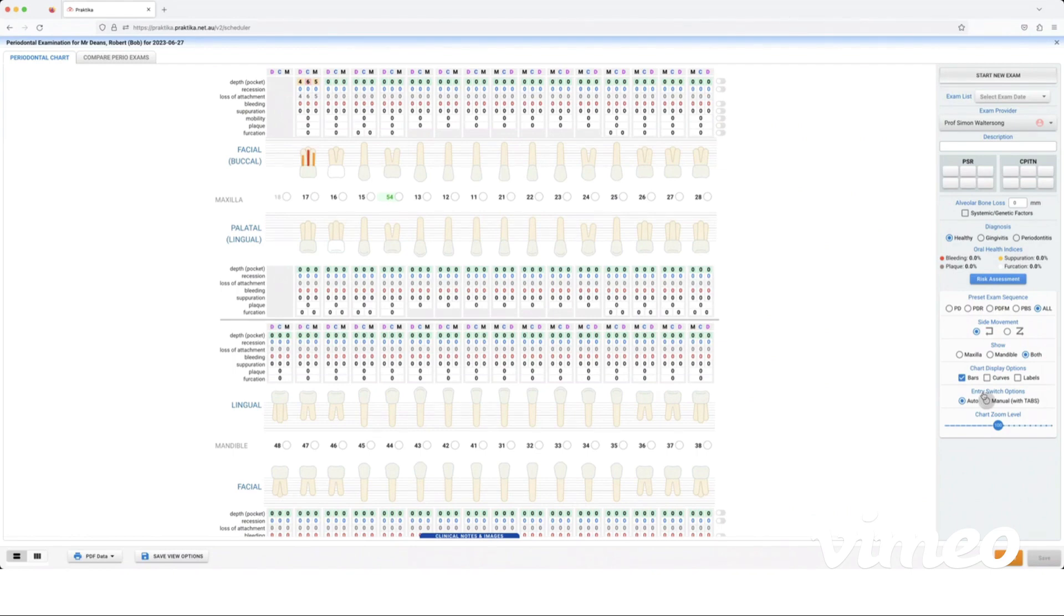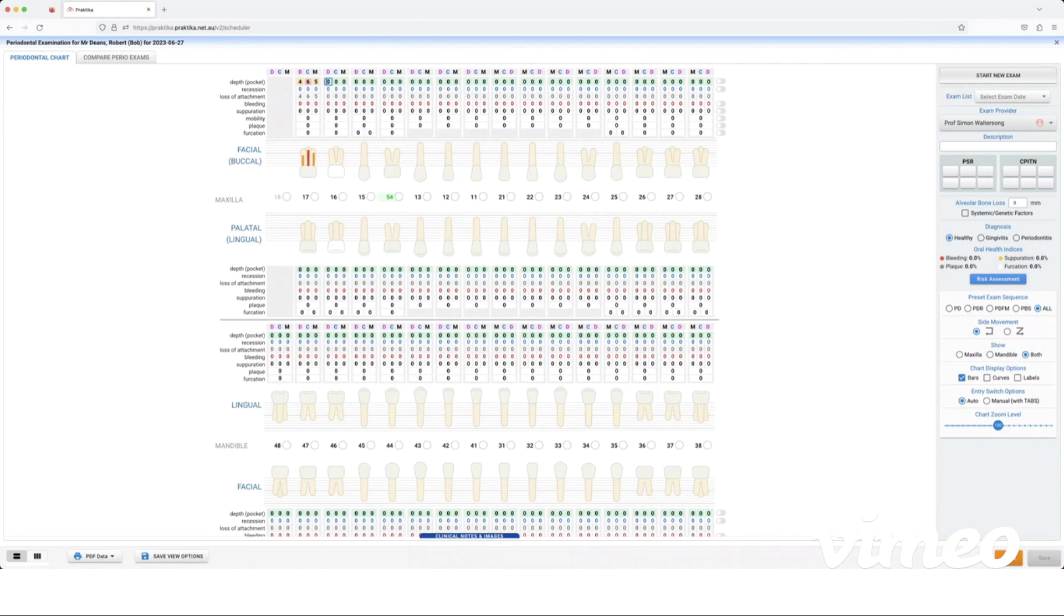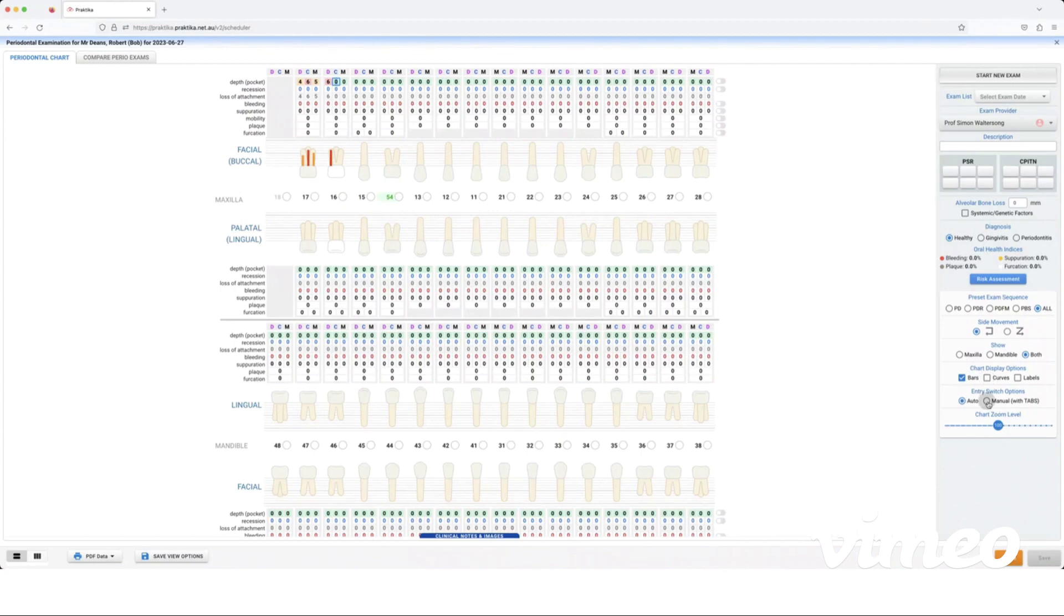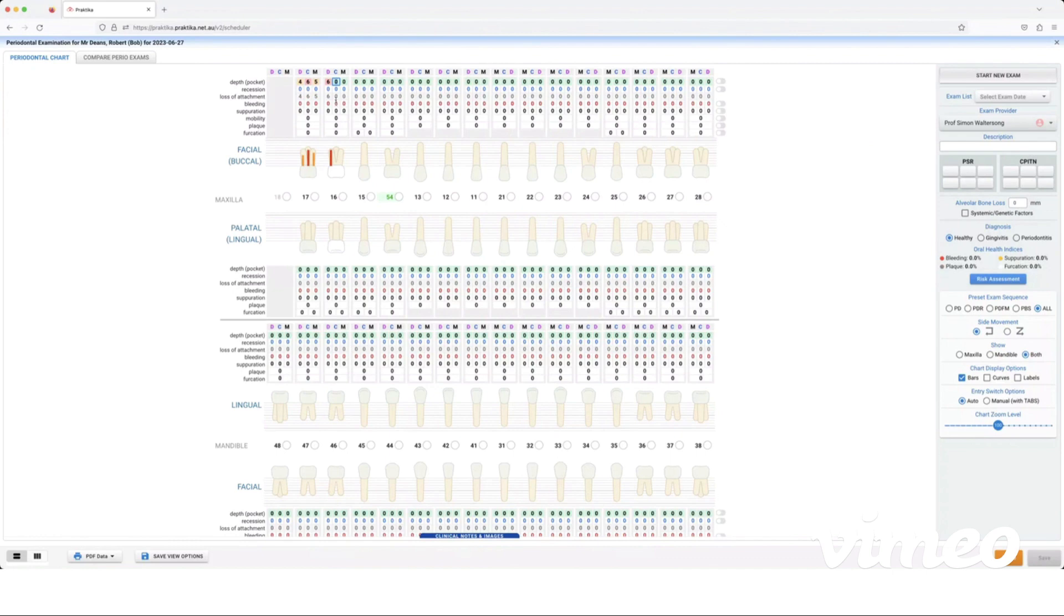Now entry switch options here: auto means that we're just going to enter in a single digit and it will automatically put you to the next box. So enter a six here and it's automatically going to put me on to the next box. If I turn it on to manual, because perhaps maybe I have a double digit number such as 10 or maybe 11, I will need to turn it on to manual, so manual with tabs.